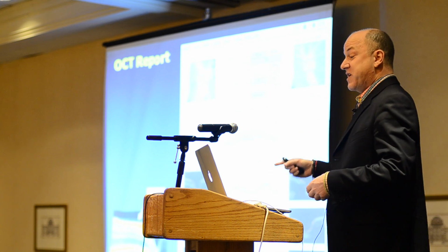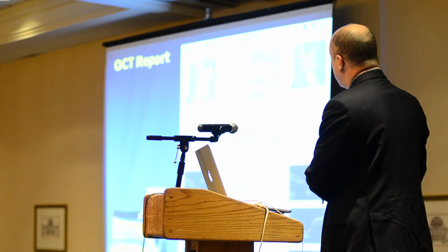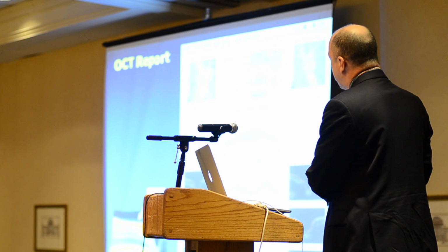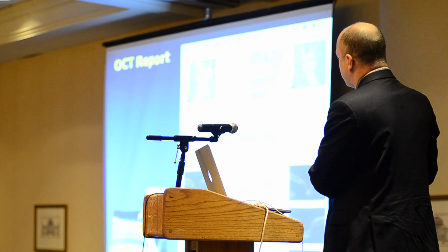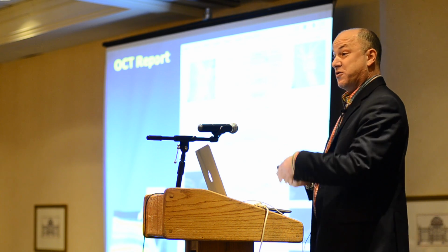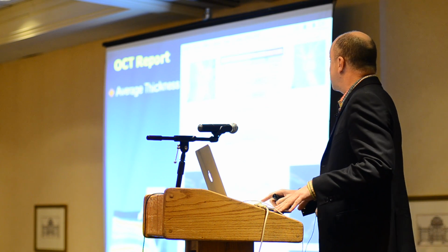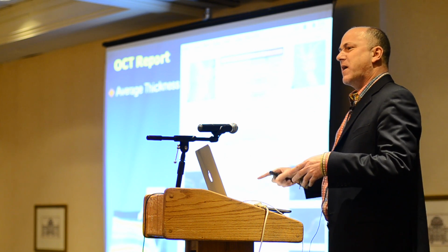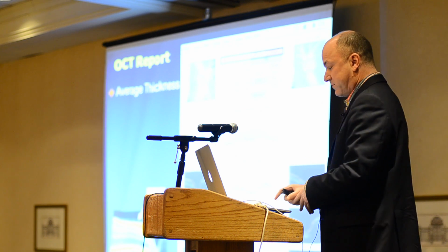And we're measuring a 360-degree circle, starting here and measuring clockwise around, getting you an average thickness at each point around. And because more cables enter into the top and the bottom of the nerve because of the construction, you have these two hills that are natural to have thicker optic nerve in the top and the bottom of the nerve. So the machine tells us what the average thickness is of both nerves. So it calculates all the way around the circle and then averages the number. That's that 100 number I gave you.